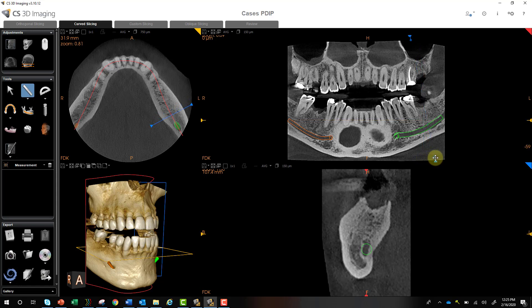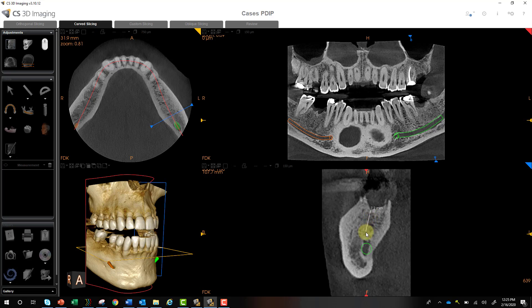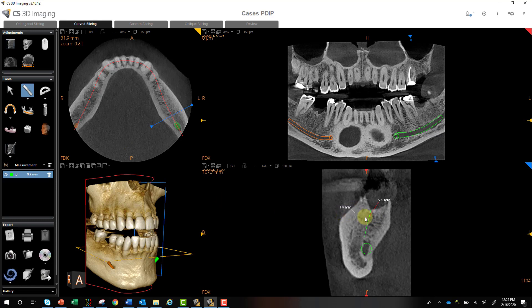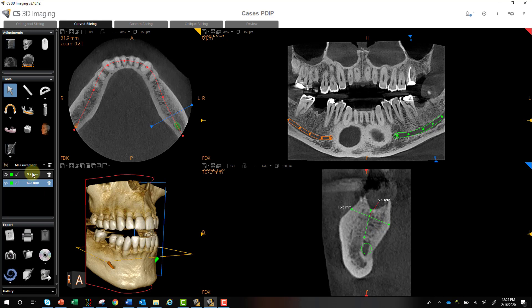Change your slicing and angles, then do a single click from wherever you want to begin measuring to the next click. You can see 9.2 millimeters. If you want to take another measurement, go back to your ruler and take another one. Down below you can see the two measurements listed, and you can hide, change the color, or delete each individual one or delete both.